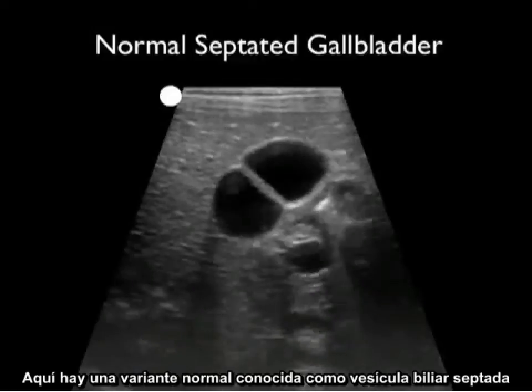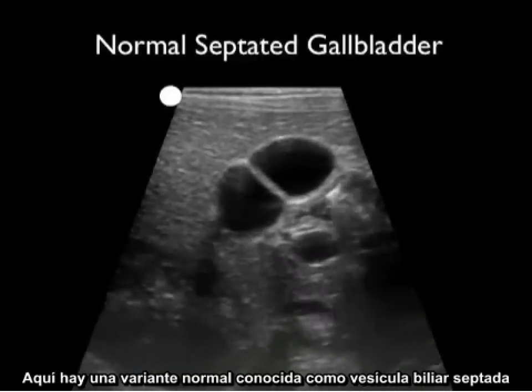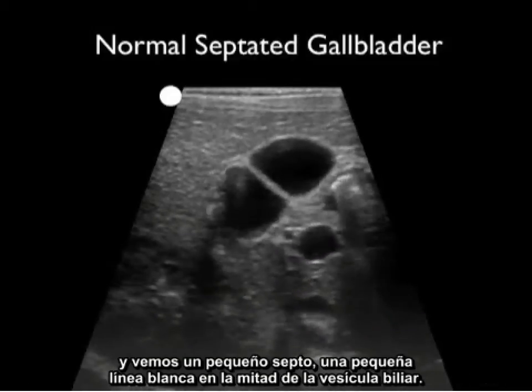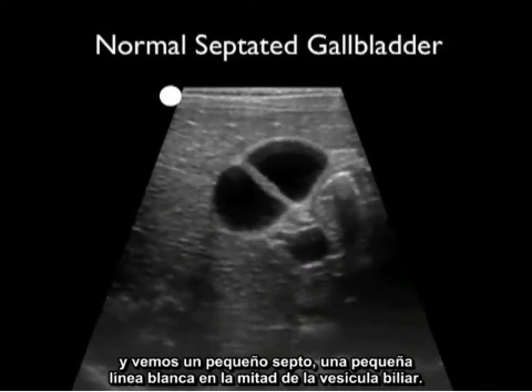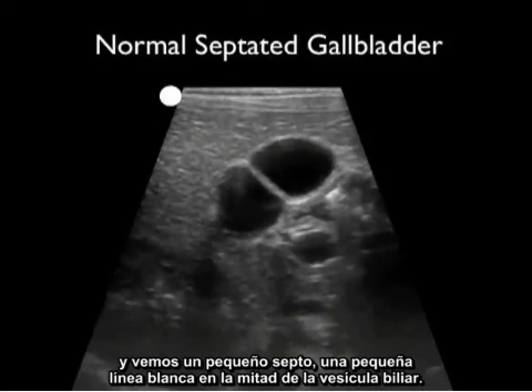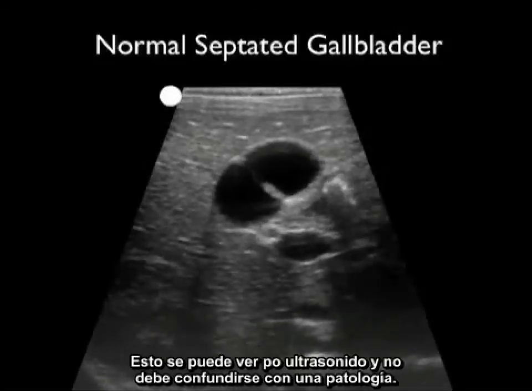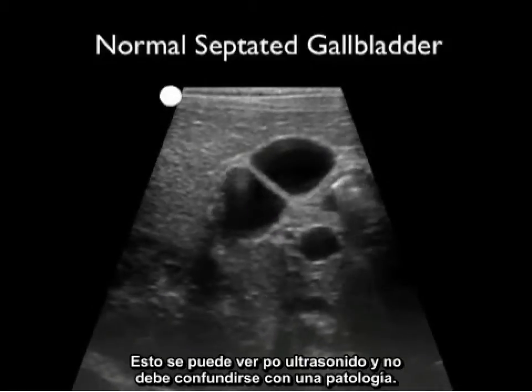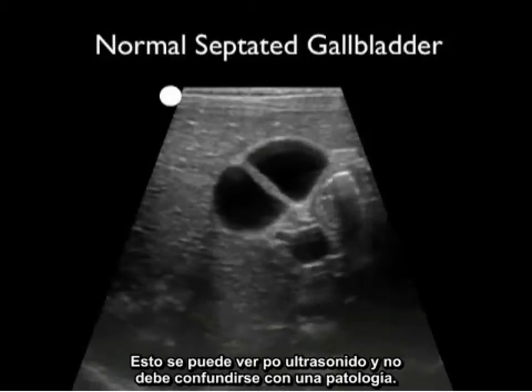Here's a normal variant known as a septated gallbladder. We see a little septum — a thin white line going through the middle of the gallbladder. This can be seen on bedside sonography and is not to be mistaken as pathology.